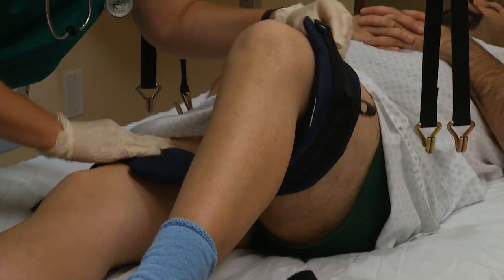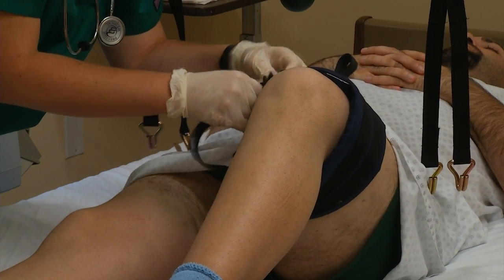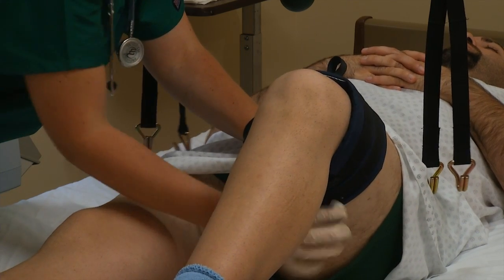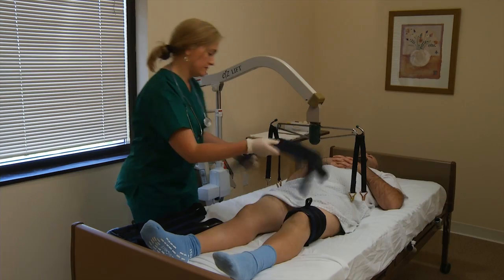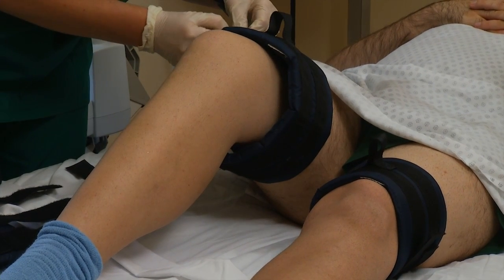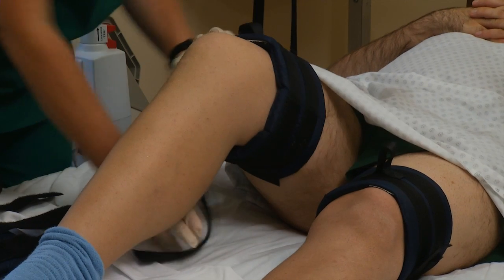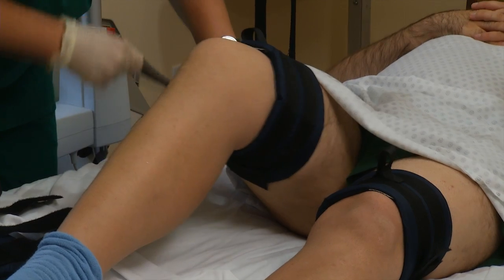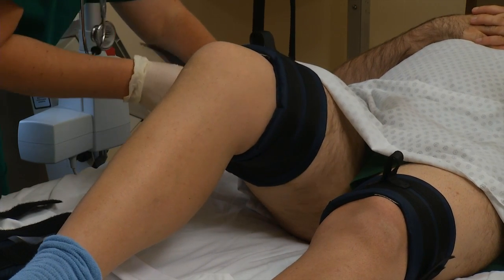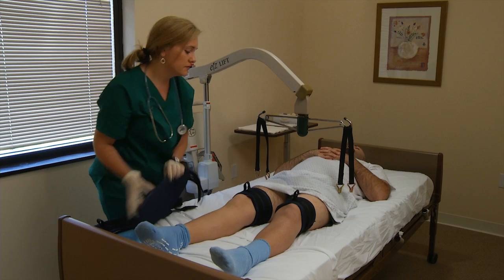The caregiver begins by securing one set of straps to the patient's thigh, just above the knees. The other set is placed below the knees, on the calves.